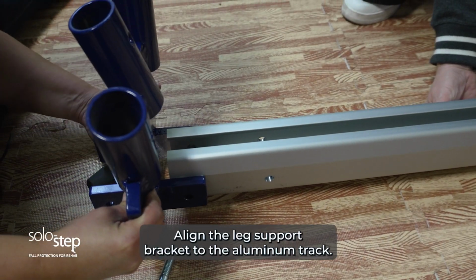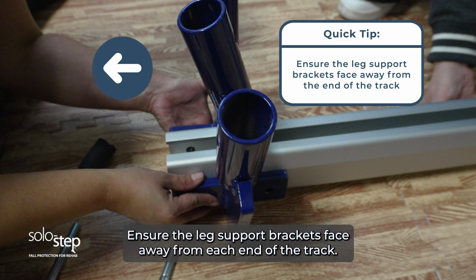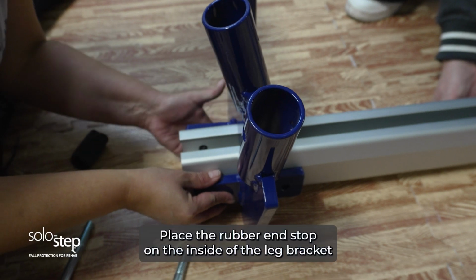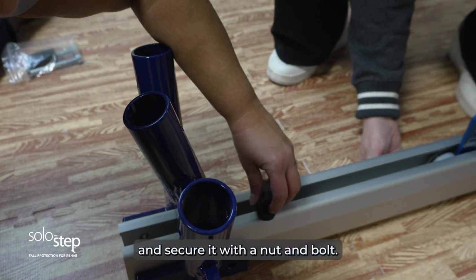Align the leg support bracket to the aluminum track. Ensure the leg support brackets face away from each end of the track. Place the rubber end stop on the inside of the leg bracket and secure it with a nut and bolt.